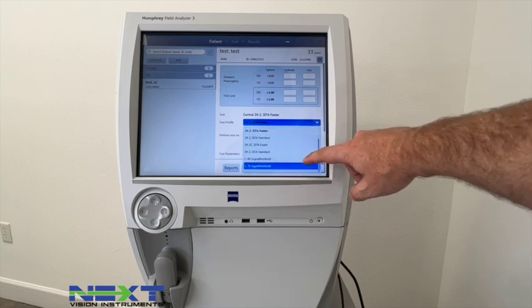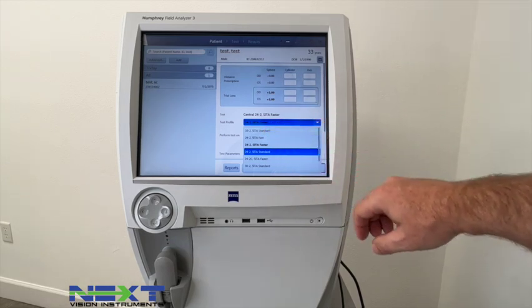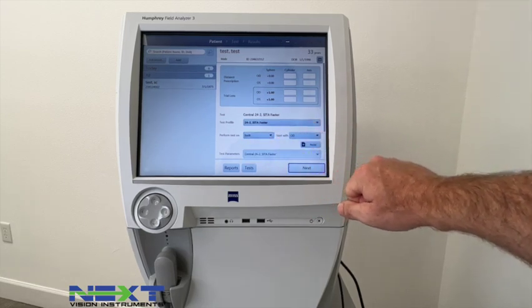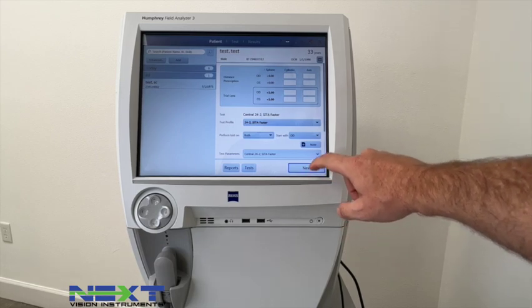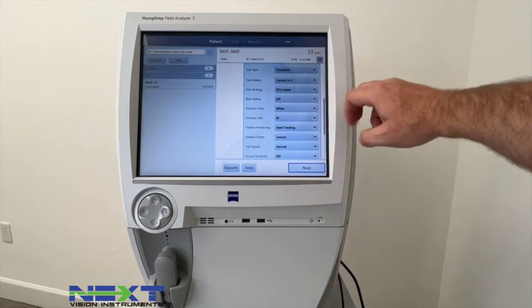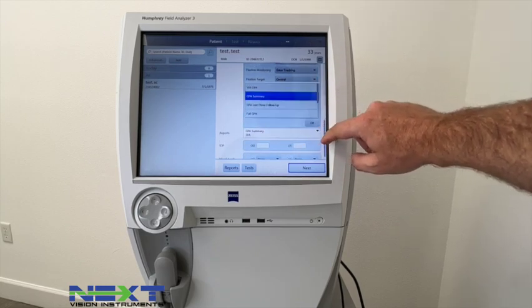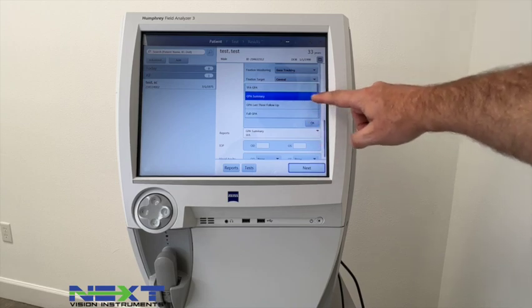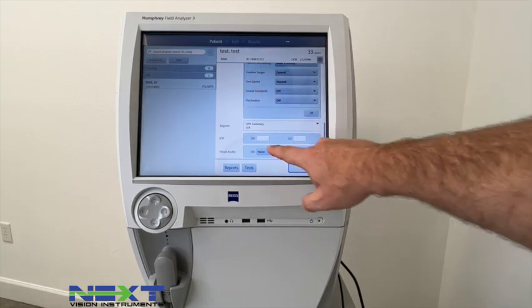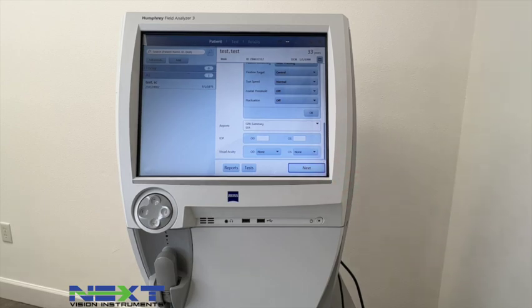You can then select which test you'd like to do — 24-2 Fast, 30-2, and there's a whole bank of tests you can scroll through. The 10-2 is also available. We're going to stick with the 24-2 and perform tests on both eyes, starting with the right eye. You can also change test parameters here: different color stimulus, fixation target. The GPA summary will be here where you can select the last three or the full GPA, and you can also enter pressures and visual acuities.